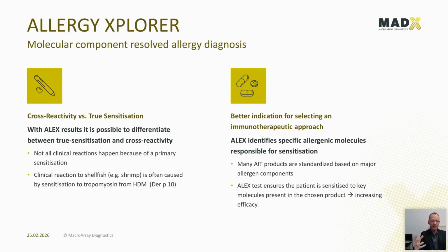If we do an ALEX test, we can cross-check that the patient is sensitized to the allergens present in the immunotherapeutic product, in which case the therapy is likely to be more efficacious and more likely to result in a positive outcome for the patient.